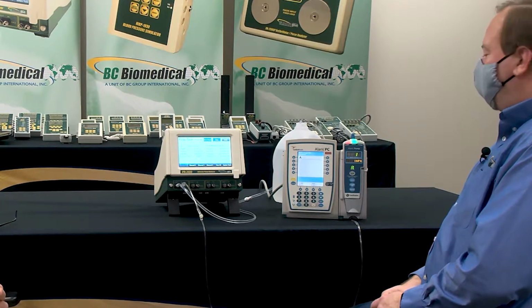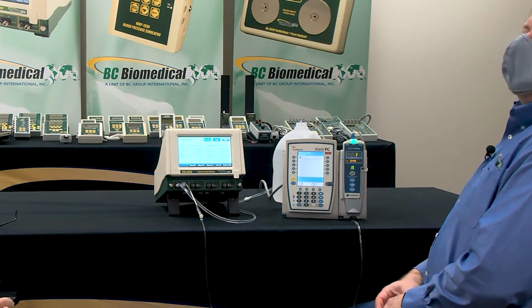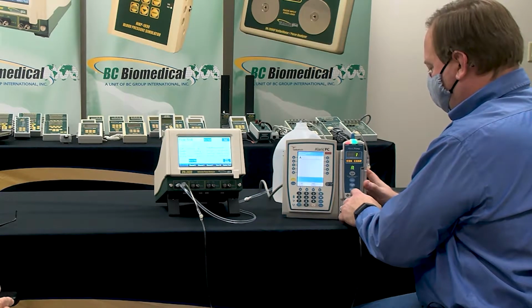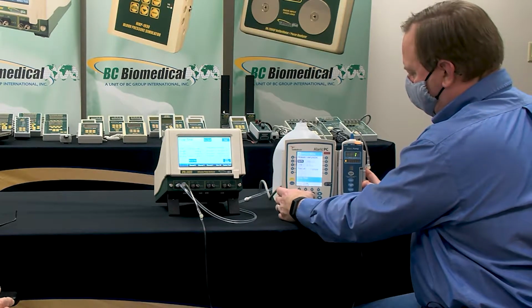You don't set any pressure. The pressure's based on the flow rate. The flow rate. Okay. Yep. So this is that, and that's a great question. So let me stop that one.